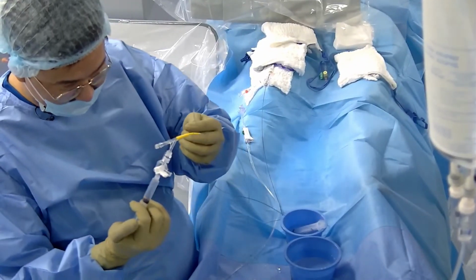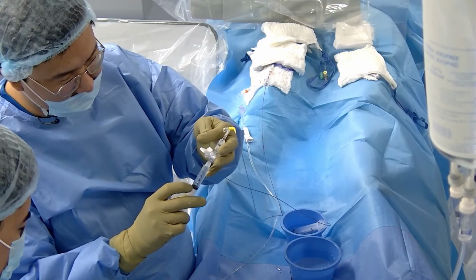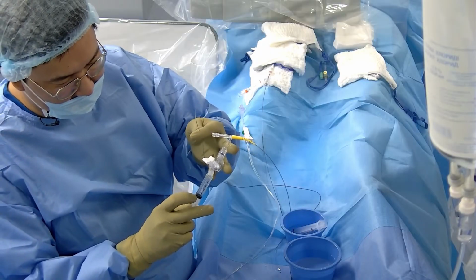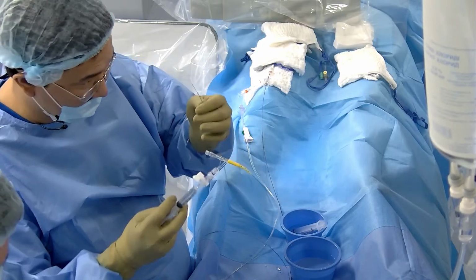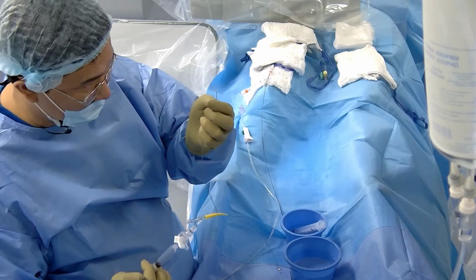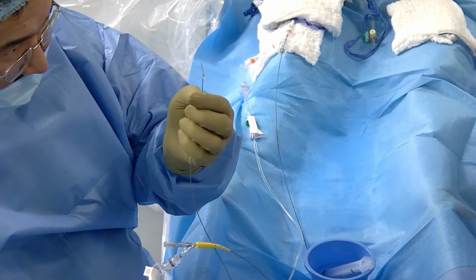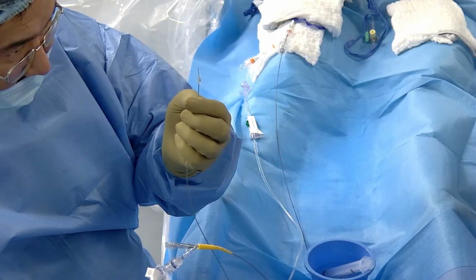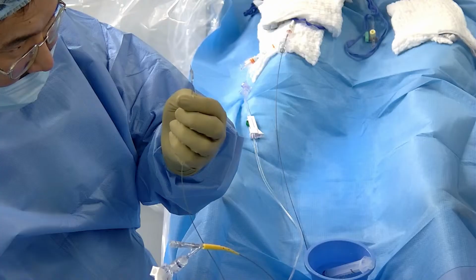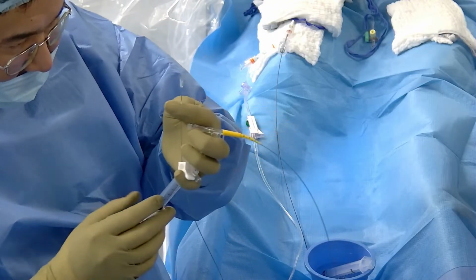Now we are preparing with a 5 cc syringe, 3 cc contrast, 2 cc saline. It's 60%. Just taking the syringe like this, the Scepter 4 by 15, it's a Scepter C. And now I'm inflating the balloon. We had several balloons for the last 2-3 years with a small hole. It's damage from the manufacturer.